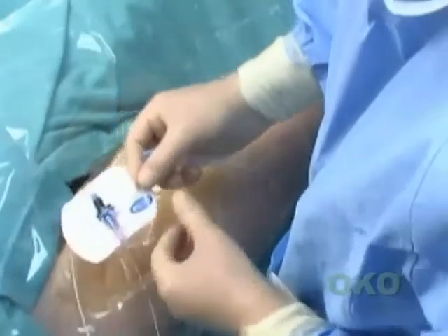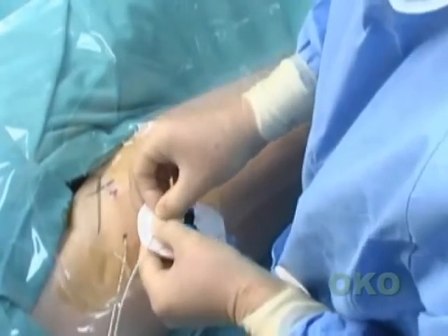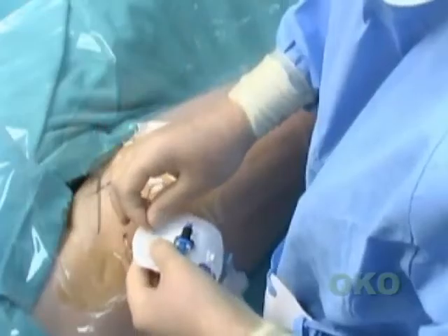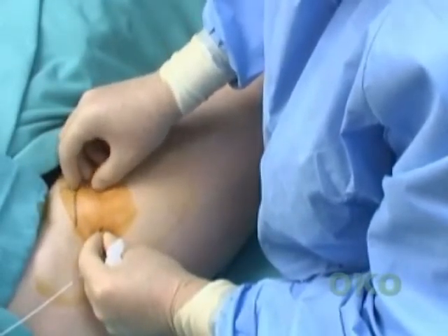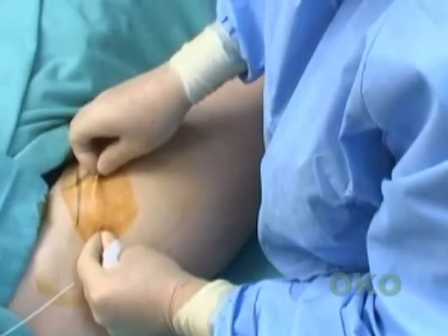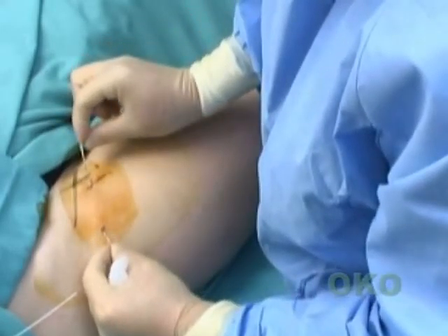The catheter and snap lock is placed in the stat lock, which is placed in a convenient position, usually on the patient's abdomen. Catheter removal is a sterile procedure and is done after the patient does not require the continuous nerve block any longer and after full sensation has returned to the leg. The proximal end of the catheter is fixated with the left hand and the distal end is removed from the skin bridge. This part of the catheter is kept sterile and the rest of the catheter is removed.